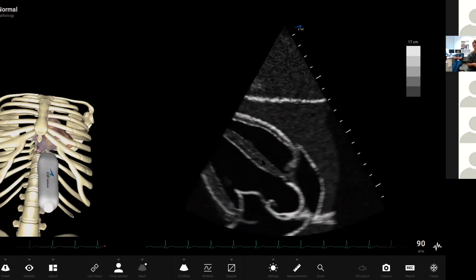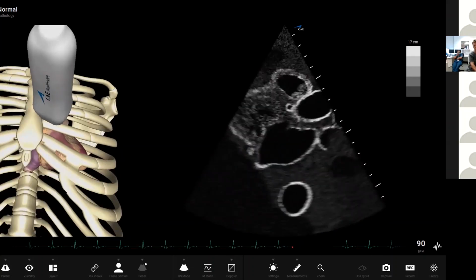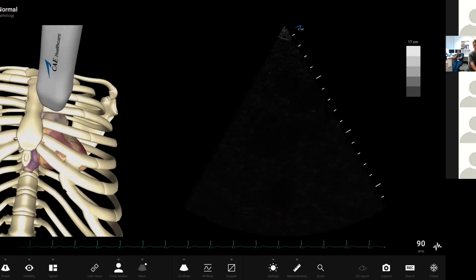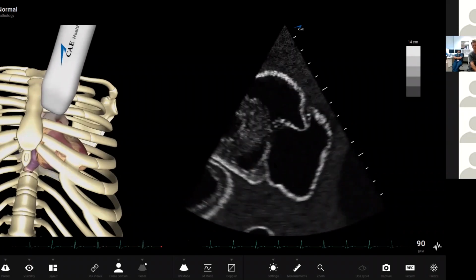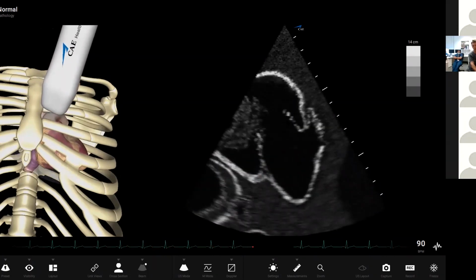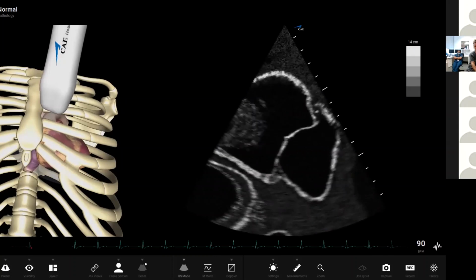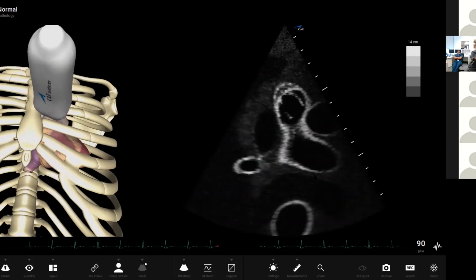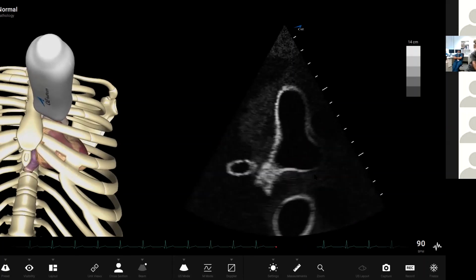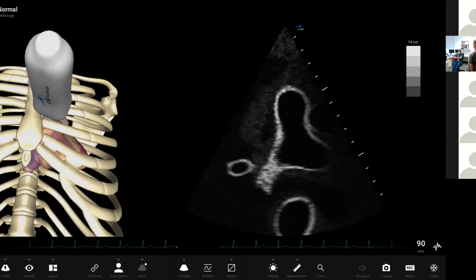Okay? All right, so after you've got your subcostal view for the Dopplers, after you got your parasternal long axis view, we're going to start fanning down towards the right hip, and you get this RV inflow view. Obviously, that's the view where we can start having a look with color Doppler to see if there's a tricuspid regurg jet. I got no obvious tips and tricks about that. We can then tilt upwards so that we can start to build in the pulmonary valve, and we get a nice axis down there from the echo down through the pulmonary valve.